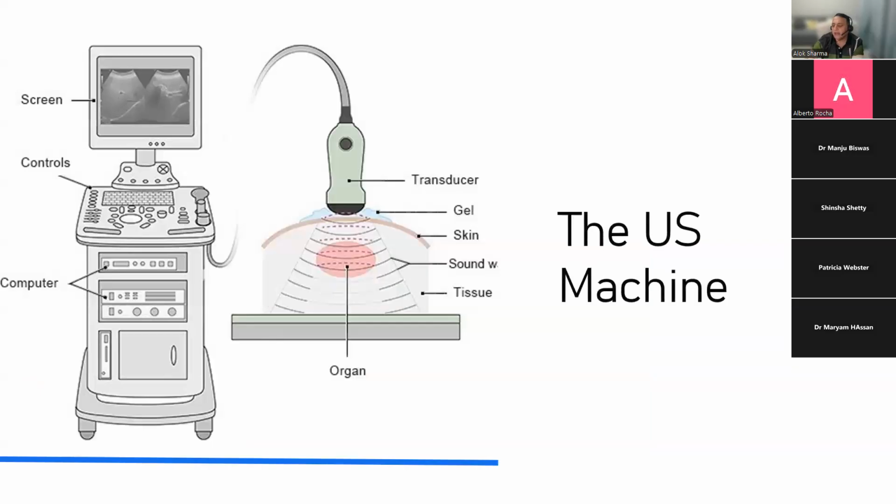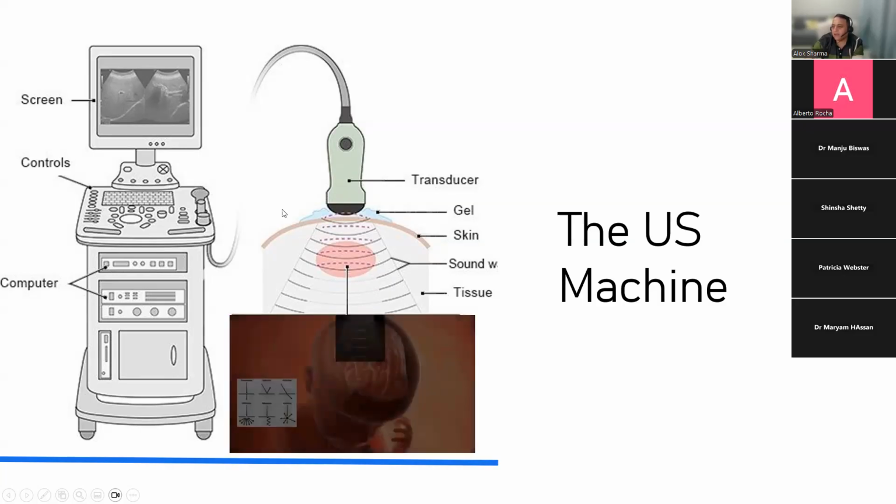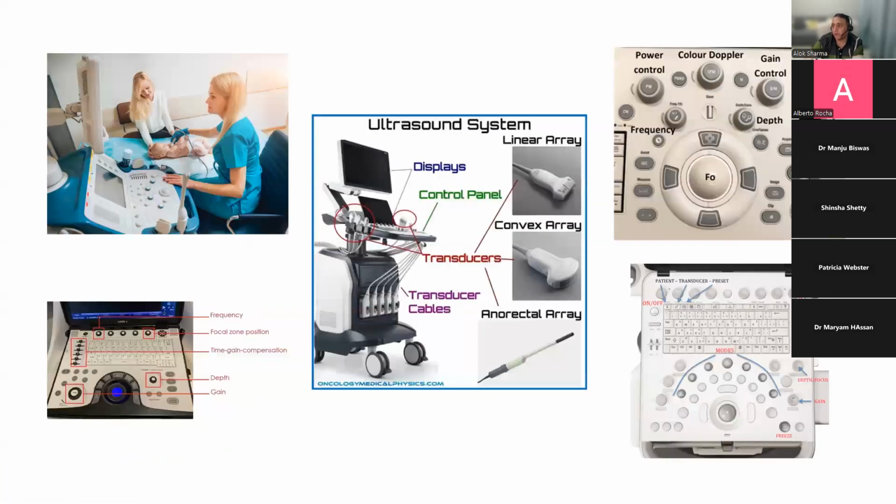Now, at the end, when we use the ultrasound machine, what we're basically doing is using the gel and the acoustic interface with the organ to give you a high quality image on screen. These images, as we know with the properties of sound, produce an image which the machine translates into a picture. And what is very important is that you then capture this picture in the ultrasound machine and store it on a drive. And we'll talk about that later.